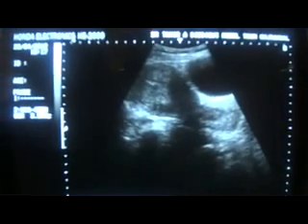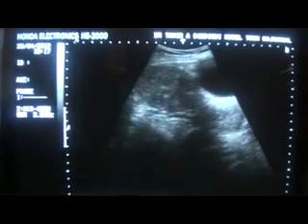This ultrasound study is being performed to rule out the cause of menorrhagia in a 38 years old married female.